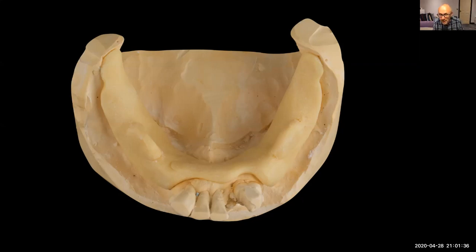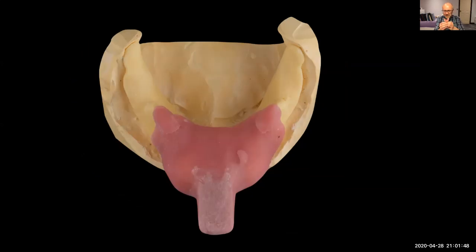If you look it up on my denture construction manual, it's got all the design steps on the download. But so that's the back there. And then over the top of that, we make a second tray. I've actually got one here because I'm about to do this for a patient at the practice when I get back to work. It's 2 parts like that.